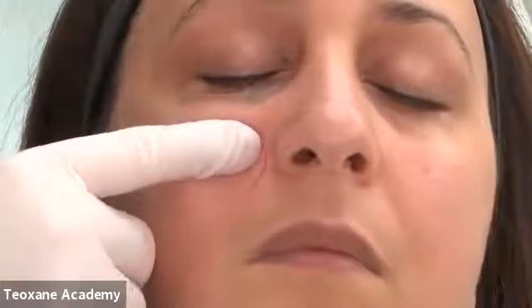So this is why, when I teach tear trough injection, I always ask beginners to do their injection in a sitting position. Like this, if they are too superficial, then the product will remain in the same place. If they do it in a lying position, the product could move downwards and create a swelling.